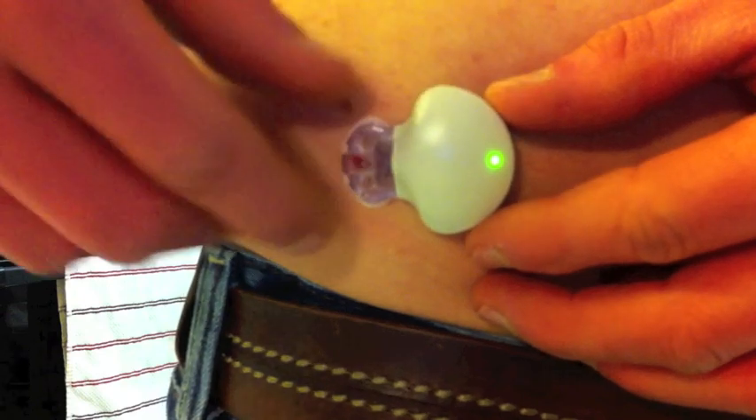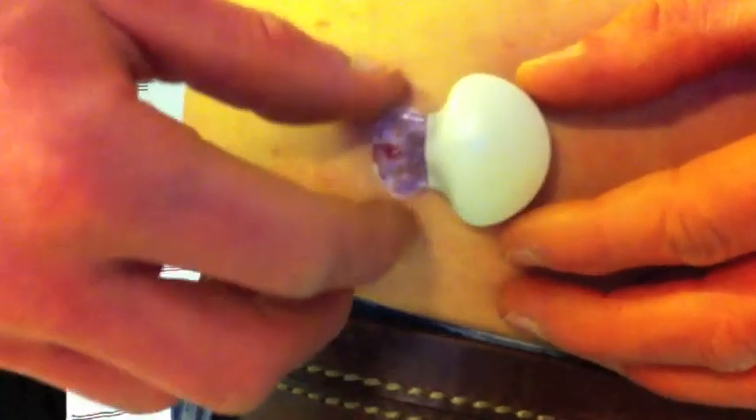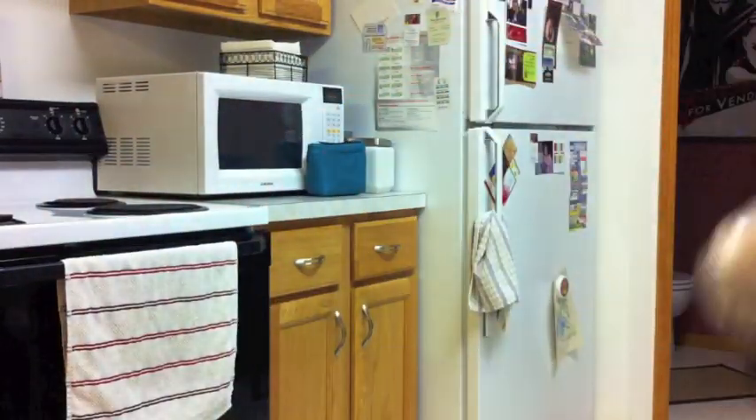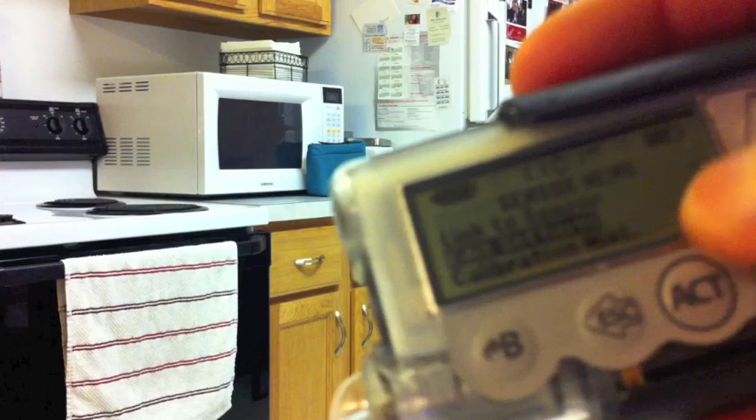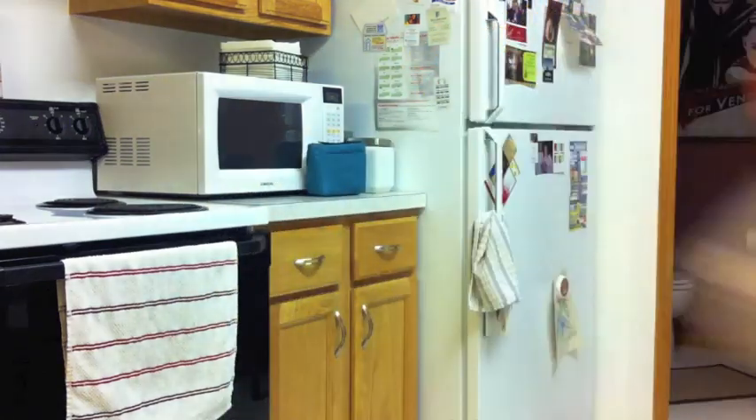Wait for the green light again — it beeps about five times and that means the insert is working correctly, it's connected with the blood and saturated. Then come over to the insulin pump, go down to sensor, edit the settings — the sensor is currently off so turn it on. Escape once to go back, go up to link to sensor, select new sensor, push act once more. You'll see the sensor icon next to the battery, and it says in two hours it'll beep telling you to do your first calibration.